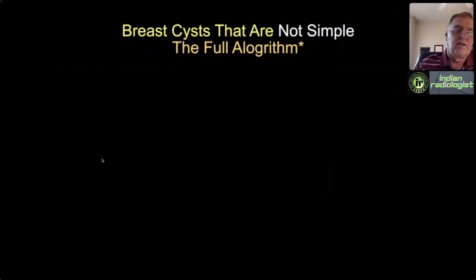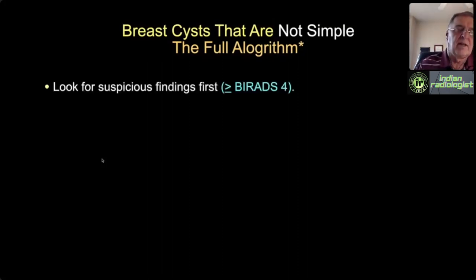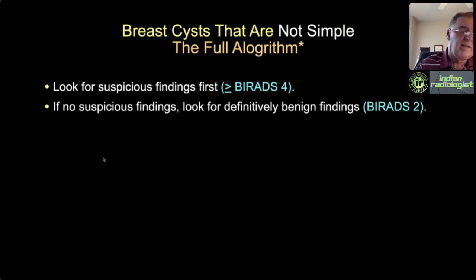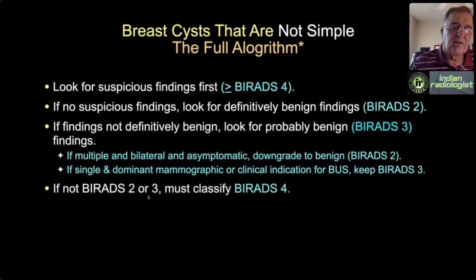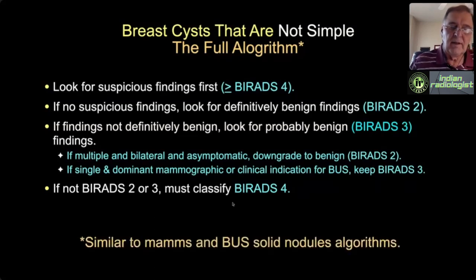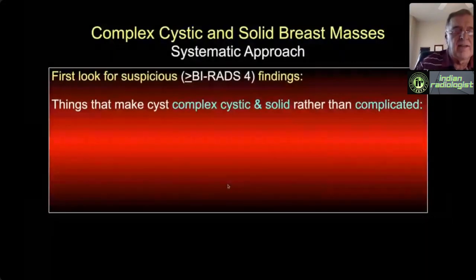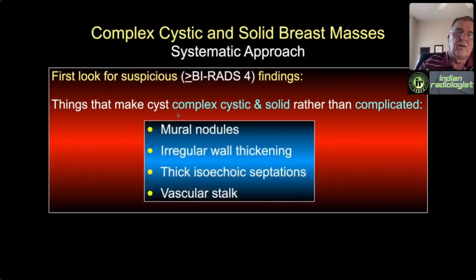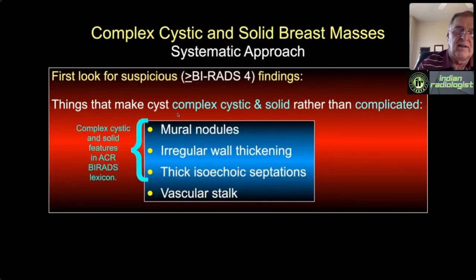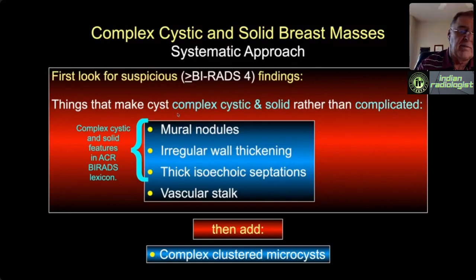Our full algorithm for non-simple cysts is essentially the same as for mammography and solid breast nodules. I look for suspicious findings first. If none, I try to find definitively benign BI-RADS 2 findings. If I can't make it BI-RADS 2, I try for BI-RADS 3 to avoid biopsy. If I can't make it 2 or 3, it's suspicious and I must biopsy it. Suspicious BI-RADS 4 or higher findings include mural nodules, irregular wall thickening, thick isoechoic internal septations, internal vascularity, and certain complex clustered microcysts.